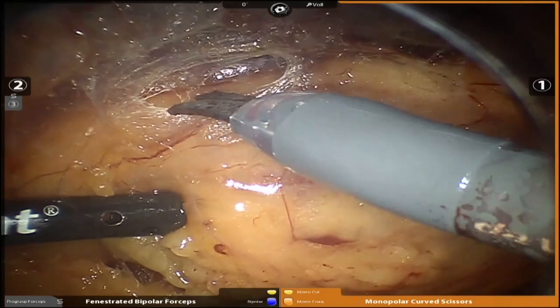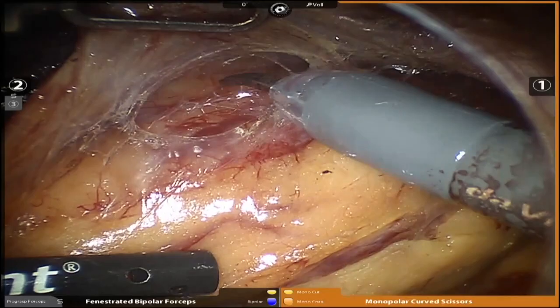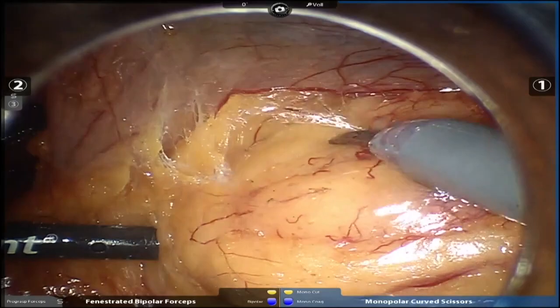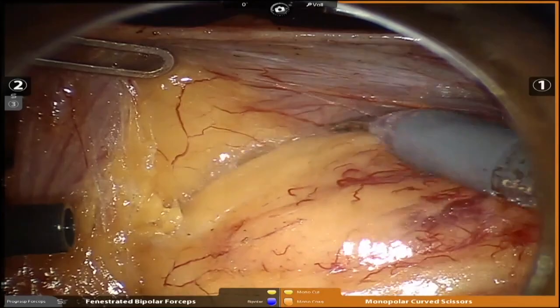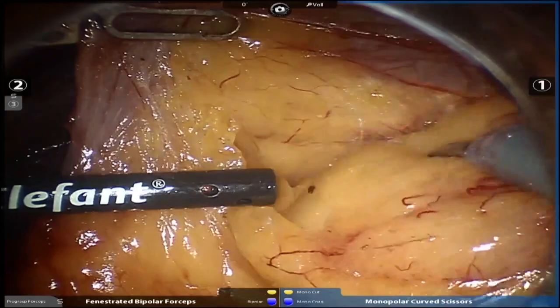Go ahead. If you were to make an inadvertent peritoneotomy here, obviously with the fourth arm, you can mitigate a lot of the problems, but do you ever place like a Veress needle into the peritoneum? No, that doesn't do anything. Yeah, it doesn't do anything. So what we do when we make a big hole is the fourth arm, like you mentioned, is the key. But if we're not, we make the hole very large so it communicates. And then if we don't have the fourth arm in place, we put the fourth arm in so that we can put the arm in under direct vision. And then we just use the fourth arm to hold the hole opening. But at the same time, we hold the kidney back or the fat back. And so we gain the benefit of the fourth arm.